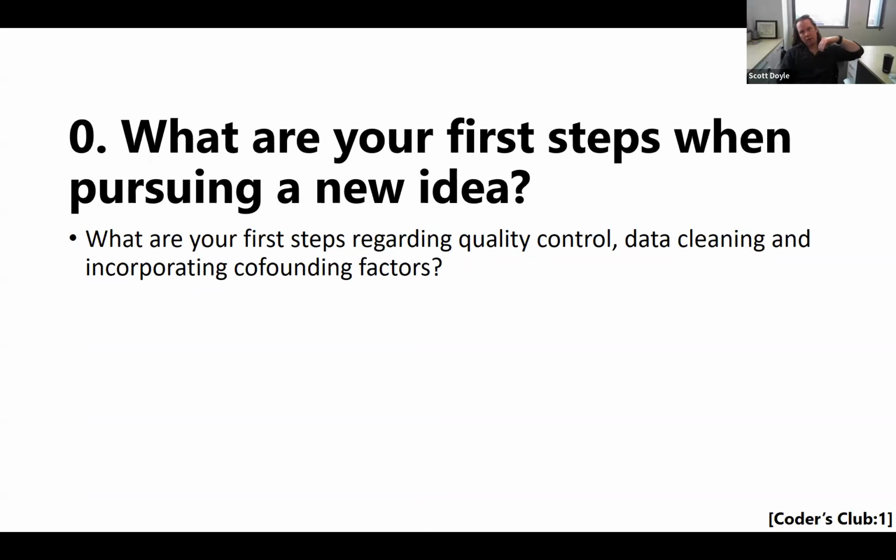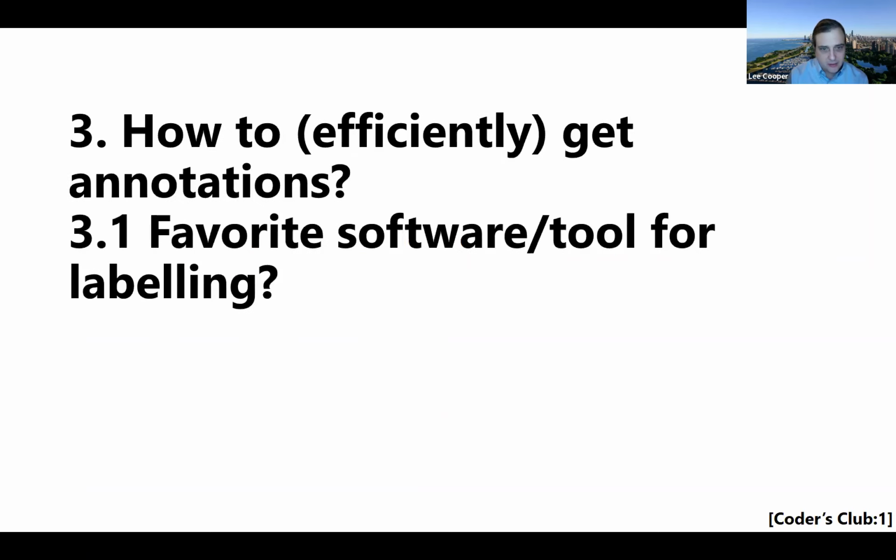Yeah, I think that incremental approach to annotation is very powerful. There's a lot of projects that are going in that direction. Obviously, it's very hard to get people to annotate things in bulk. And if you take this incremental approach, I think you can save a lot of time and energy. You have to be really careful that you're not overfitting anything though, because if you're sort of cheating and peeking at your test images, yeah, you can really highly optimize those. Yeah, that's a fair point.